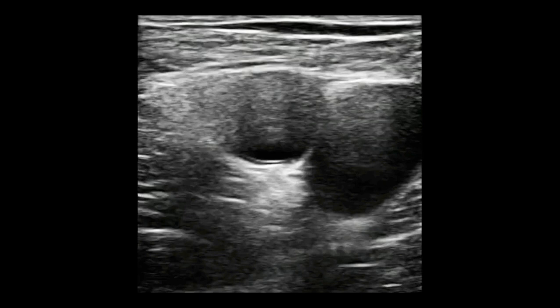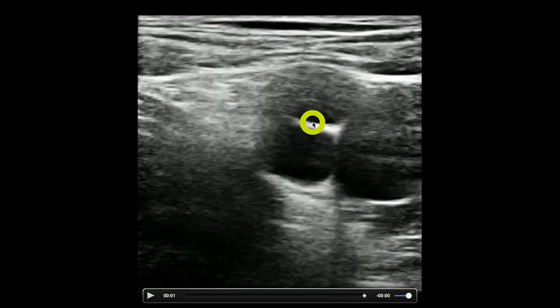Here's an ultrasound image. We have our vein, we have our artery — this is just past the split — and then this triangular structure right here is the femoral nerve. This white line here is the fascia iliaca, and that is really going to be our target: the fascia iliaca, not necessarily the nerve itself.